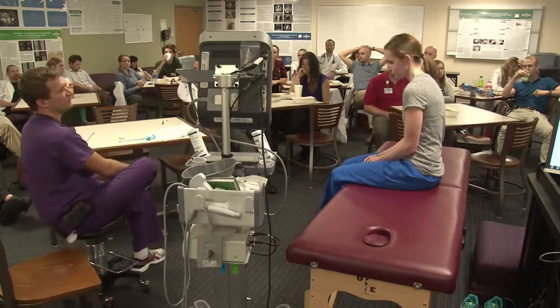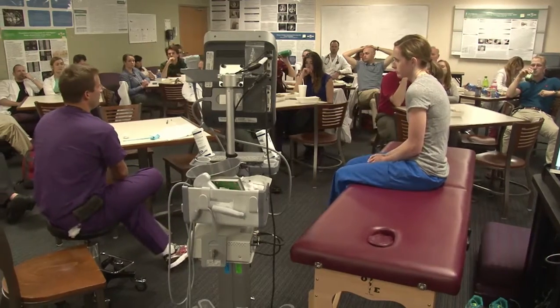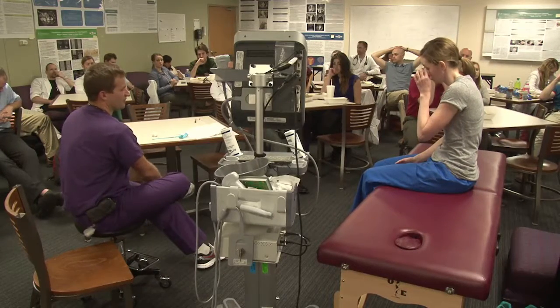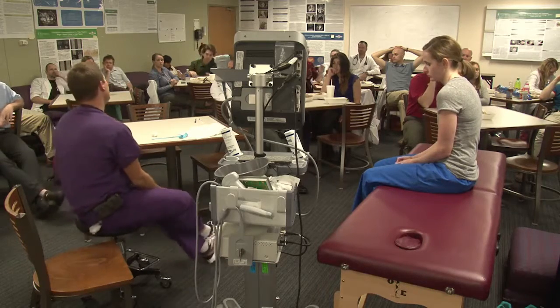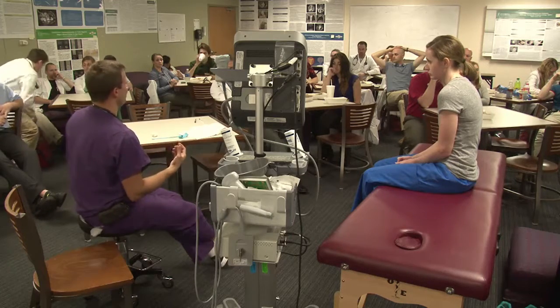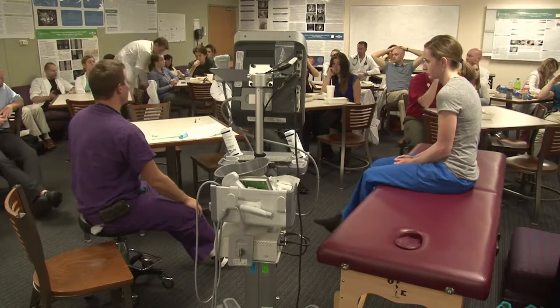Yeah, so the question was, how do I start peripheral intravenous catheters under ultrasound, and how to deal with some of the problems that can happen with them? So first of all, the view that I use is a short axis out of plane view, just like if I was doing an arterial line, just like if I personally was doing a central line.